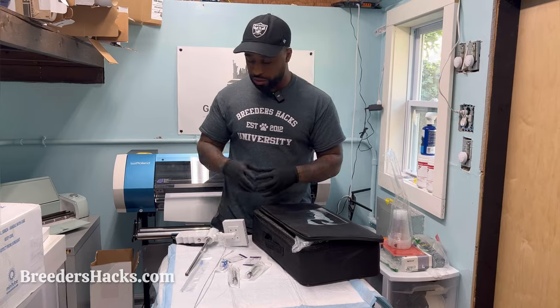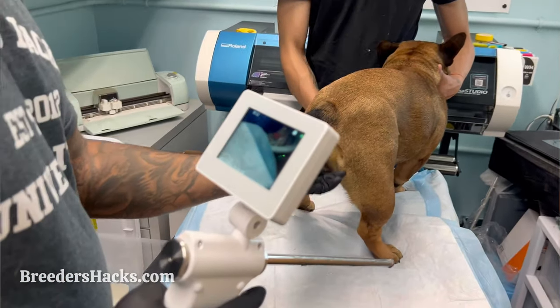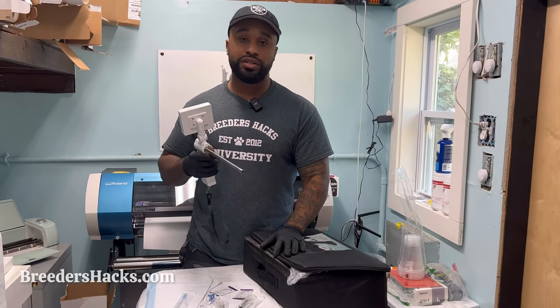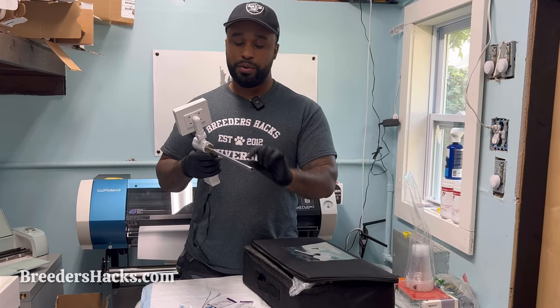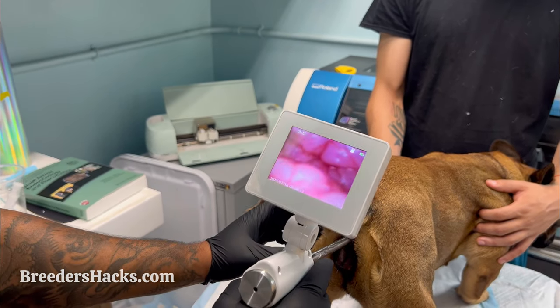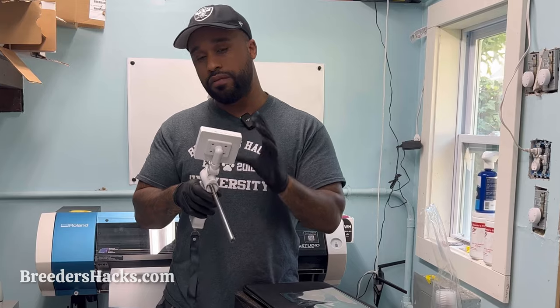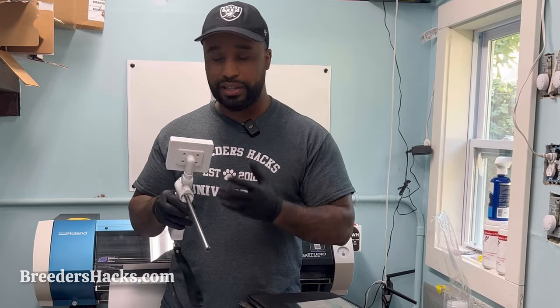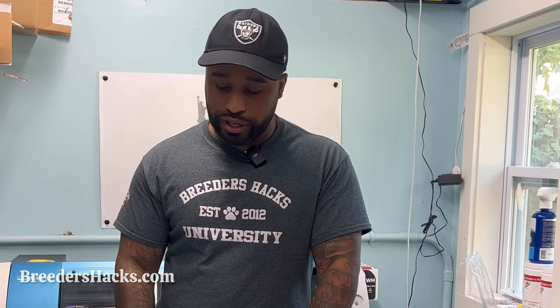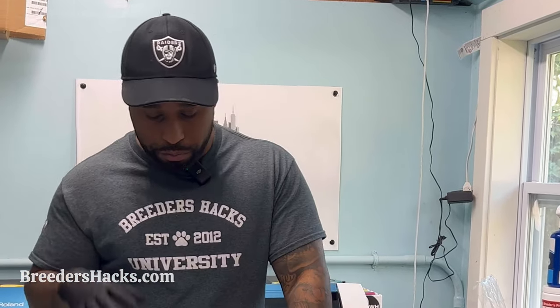Today I'm going to show you guys how to use our mobile endoscopes. TCIs are awesome — it's short for transcervical insemination. All that it means is it's an insemination just like an artificial insemination, but we have what's called an endoscope, or a camera affixed to our rod. So when we're inseminating the dog, we can actually get a visual of where we're planting the semen. Ideally, you want to make sure you're putting the semen inside the uterus, bypassing the cervix, and putting it right close to almost where you would be doing a surgical.